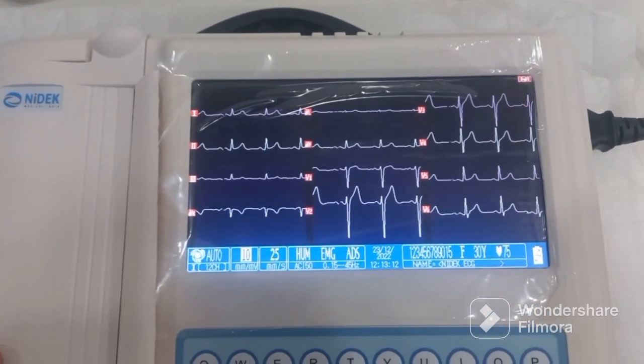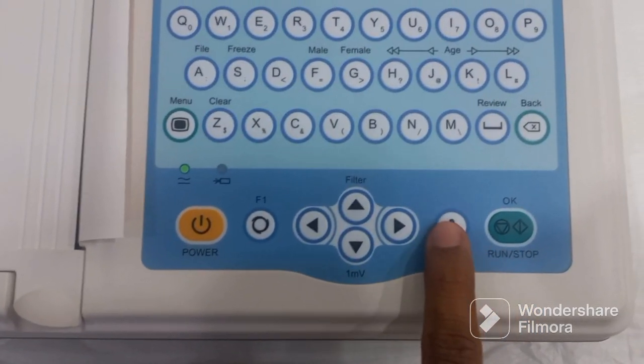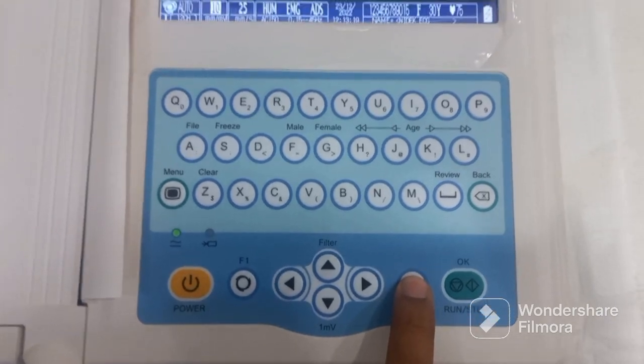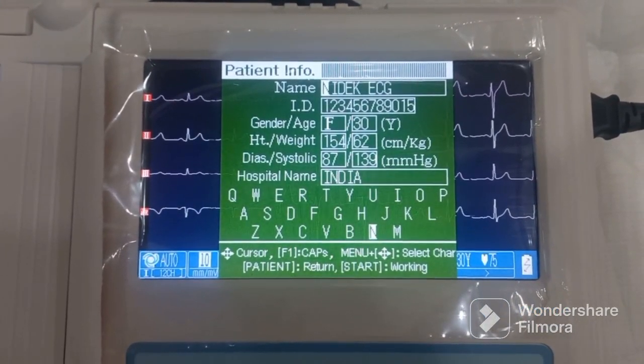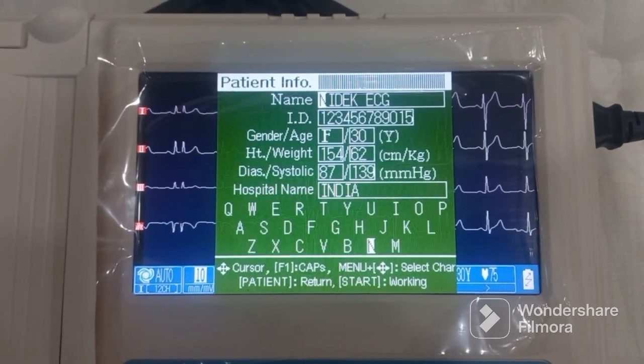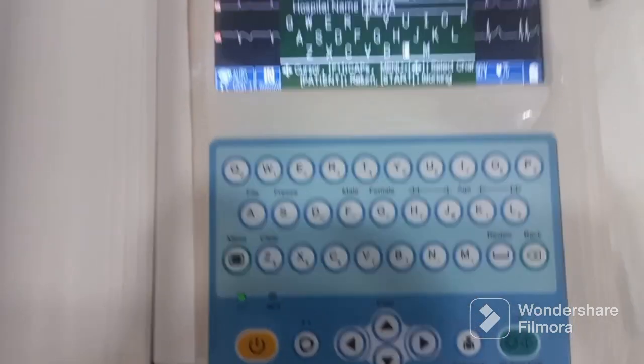Once the paper is aligned, just press the door closed. Once the paper is loaded inside the machine, we will start feeding the patient parameters. Press the patient button and this is the kind of dialog box you will see on the screen.